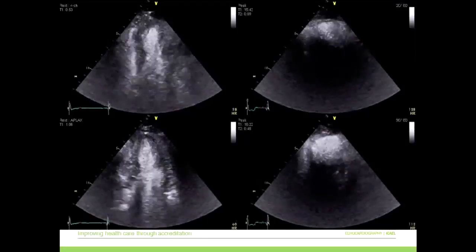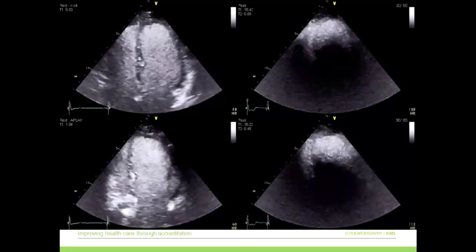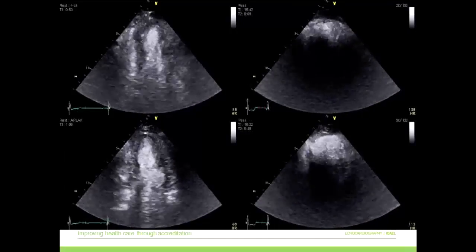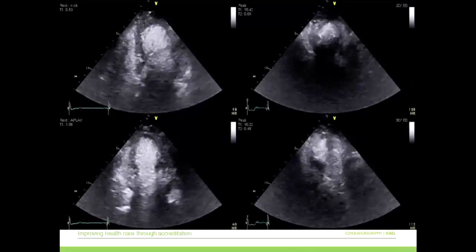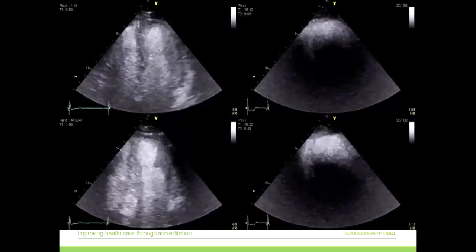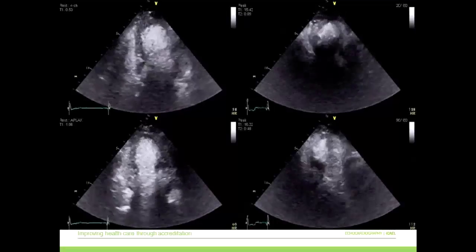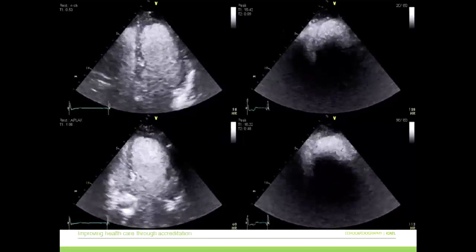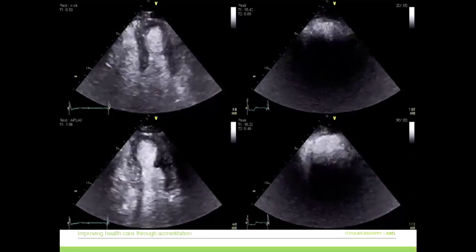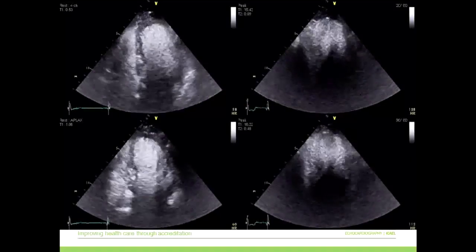Well, in this case, the patient had the resting pictures taken, and the sonographer got them really quick. The images were really nice, and the patient immediately began to walk on the treadmill, and then soon after she said she couldn't walk anymore and had to stop. And really, her heart rate did get up, not as high as we would like it, but it did increase.